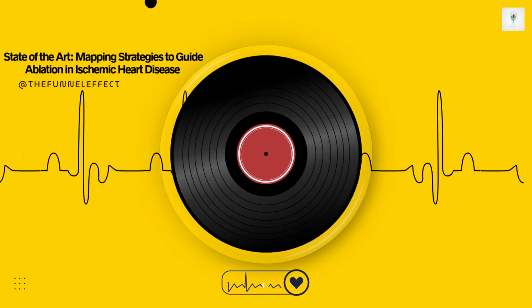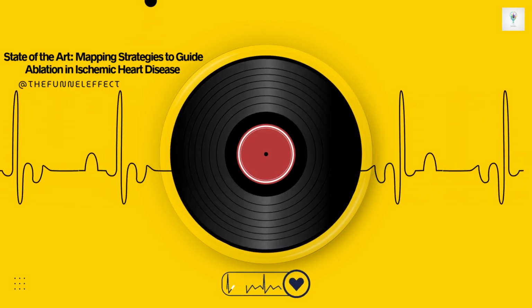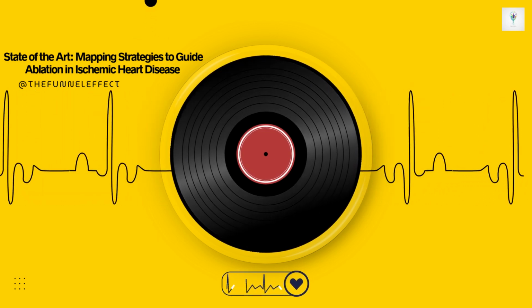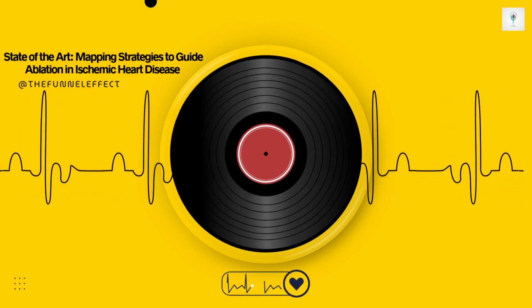So for the big scars, it's like clearing the forest and paving over the specific dangerous trails. That's a pretty good analogy, yeah. You simplify the overall landscape by ablating the really bad stuff, and then you use the more precise tools to find and eliminate the specific pathways that are still viable and dangerous.